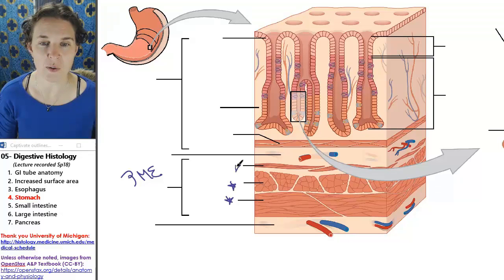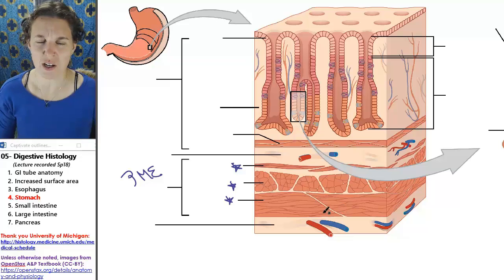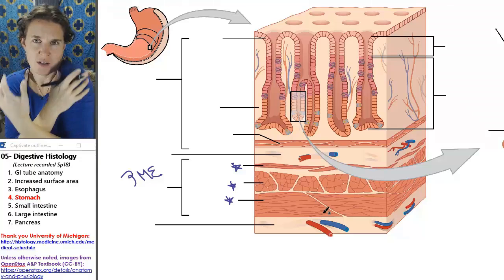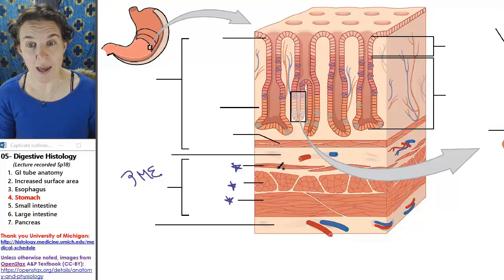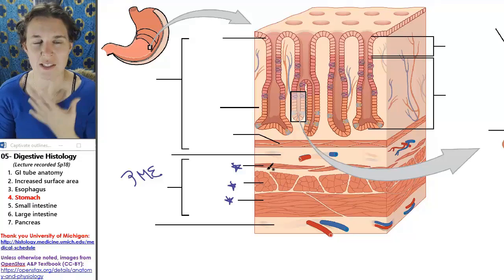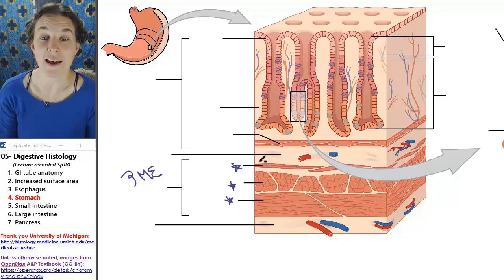1, 2, 3. I couldn't, for the life of me, explain to you how these fibers are moving through this structure. I've got this way, I've got that way, and then I've got like me way. But regardless, they're moving a different way, and they call them oblique fibers. I just don't have a sense. My spatial challengement doesn't let me understand that.